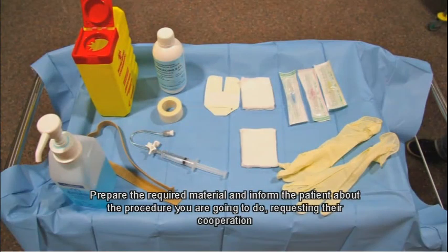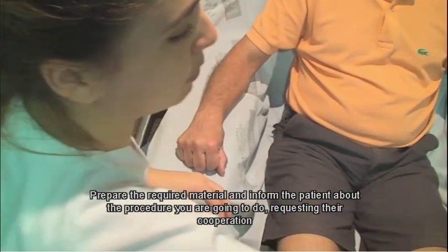Prepare the required material and inform the patient about the procedure you are going to do, requesting their cooperation.